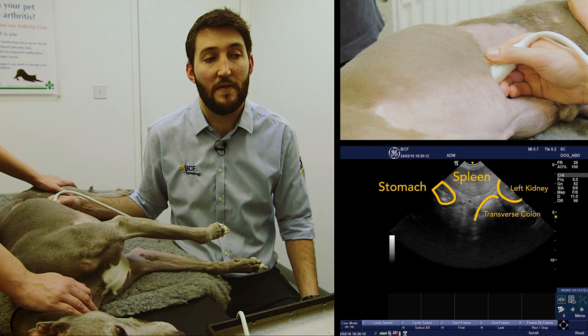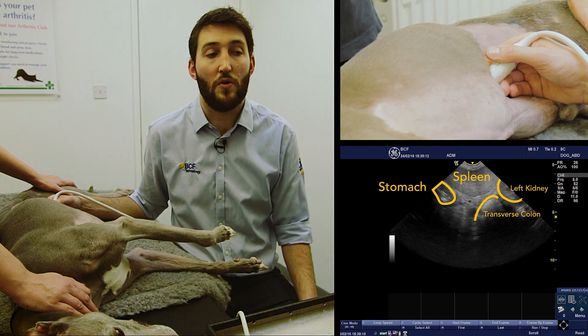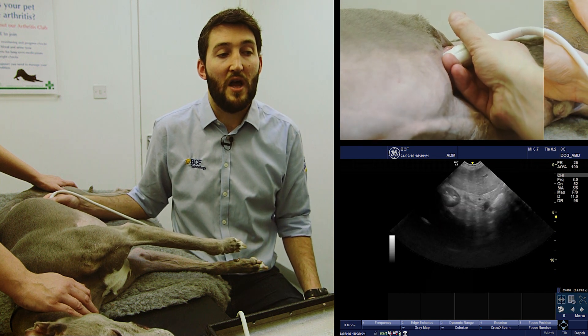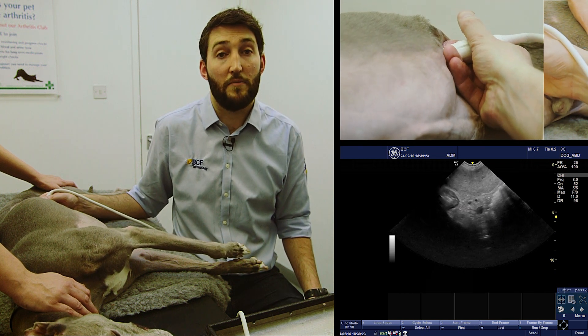Sometimes you can see the left kidney in this part of the image, or you can see the transverse colon. We're going to keep coming out along the body wall until we pick up the portal vein.